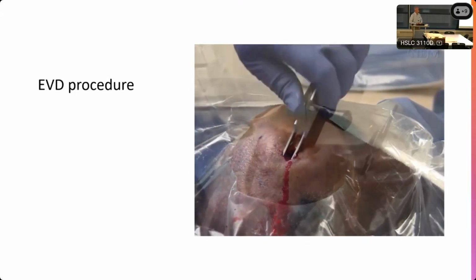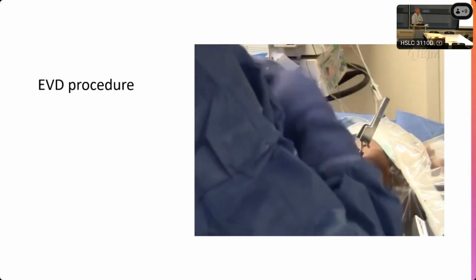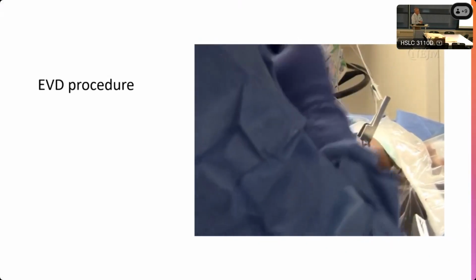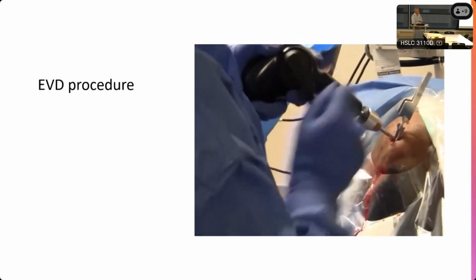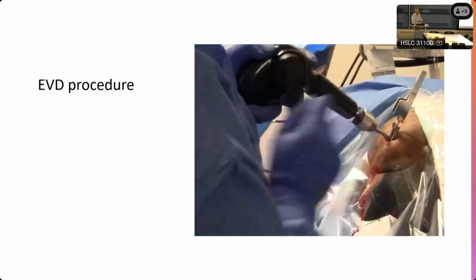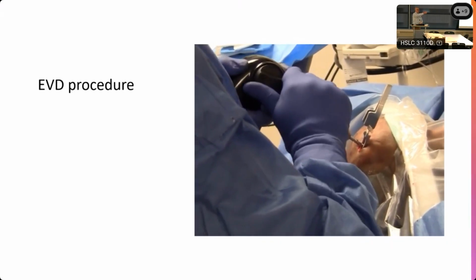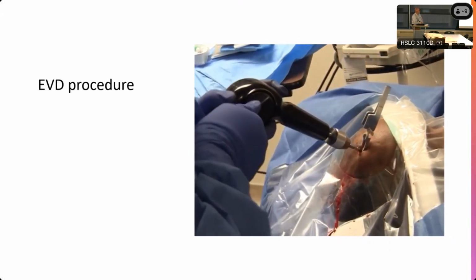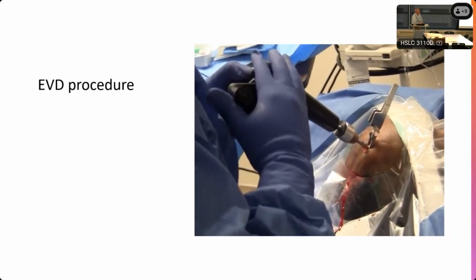Position the twist drill at the center of the incision, perpendicular to the skull. Turn the handle clockwise at a steady pace. You'll encounter resistance as the bit pierces the outer layer of cortical bone. Once the bit enters the cancellous layer of the bone, it will progress smoothly until it reaches the inner layer of cortical bone. At that point, continue to rotate the handle clockwise while applying backward pressure with your non-dominant hand to prevent the drill from plunging. Stop drilling once the drill pierces this inner layer of cortical bone.